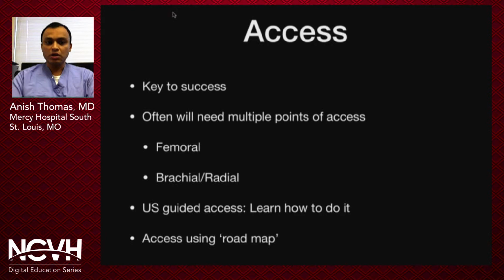It's therefore important to learn how to gain ultrasound-guided access. Learn how to do it. You may not have the ability to always use a roadmap for getting access, and we'll go through a situation where this is the case.